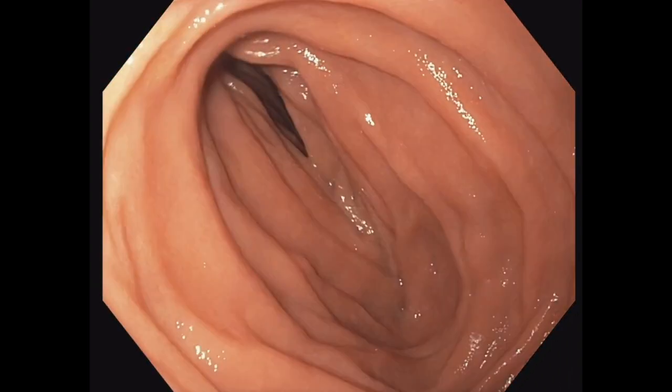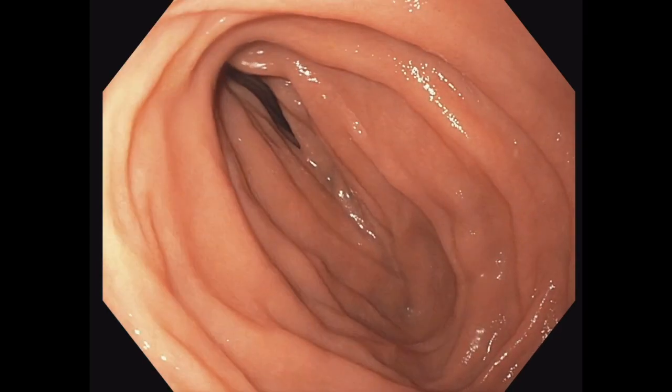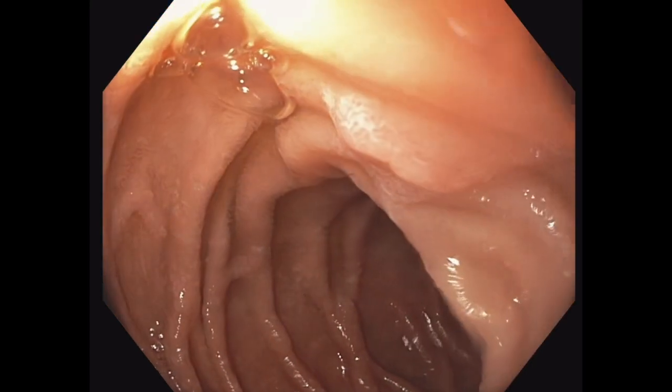Keep the view in the center of the lumen and gently pull the scope to adjust the axis of the scope. This maneuver will make scope advance distally. Then observe as you pull the scope back to the stomach. Check the duodenal papilla for abnormality also.